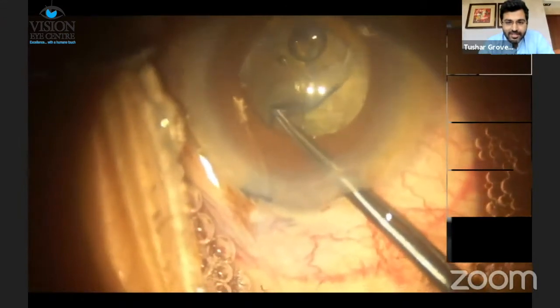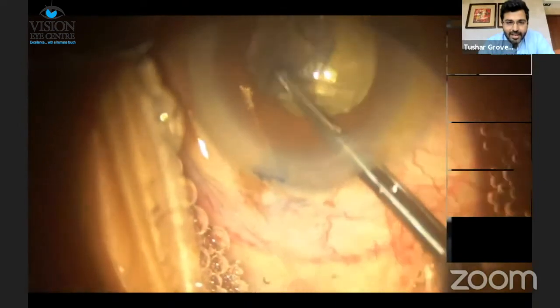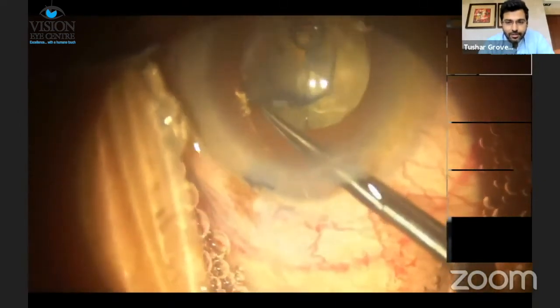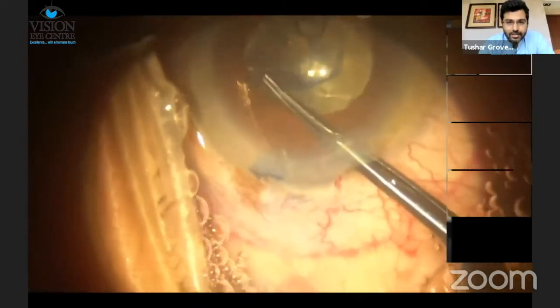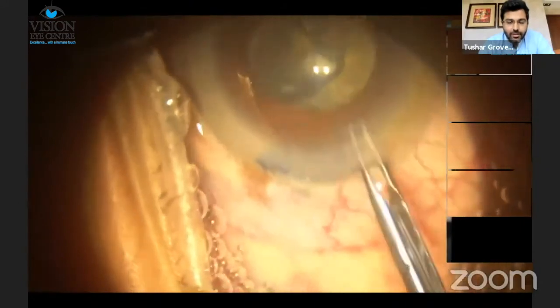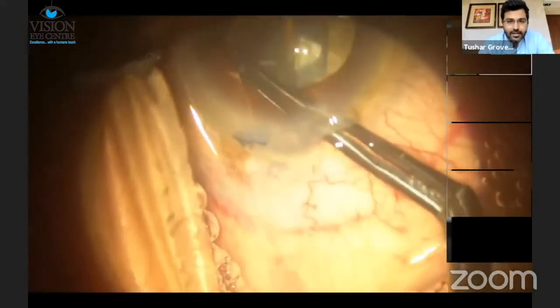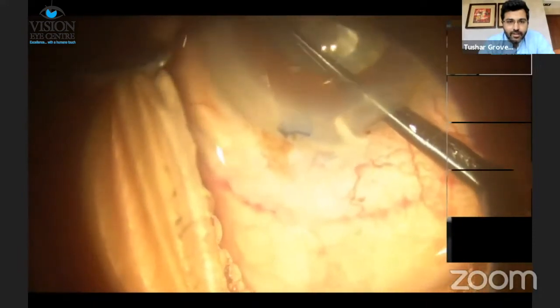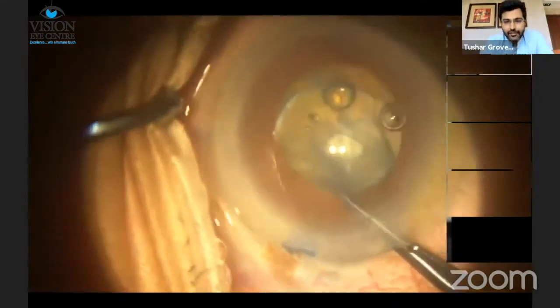So it's important to be extremely gentle and extremely careful, and to do a manual capsulorhexis in this area. If we had microforceps that could have made things a little easier, but with the regular capsulorhexis forceps, doing it very slowly and gently, we were able to satisfactorily complete the manual capsulorhexis and take the capsule out. This particular case was uneventful after that.